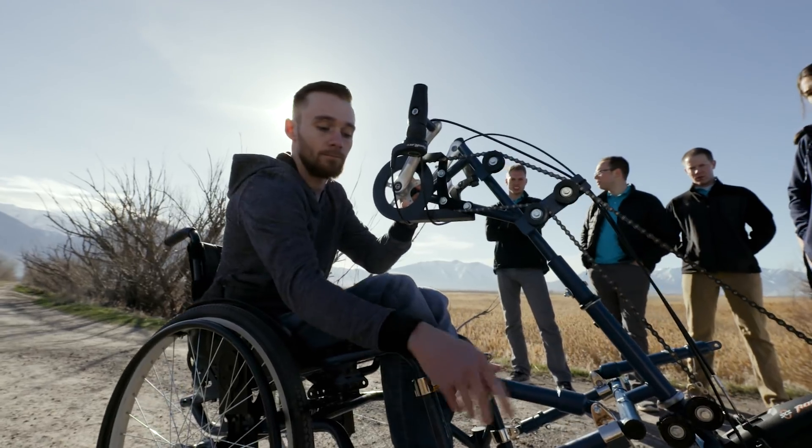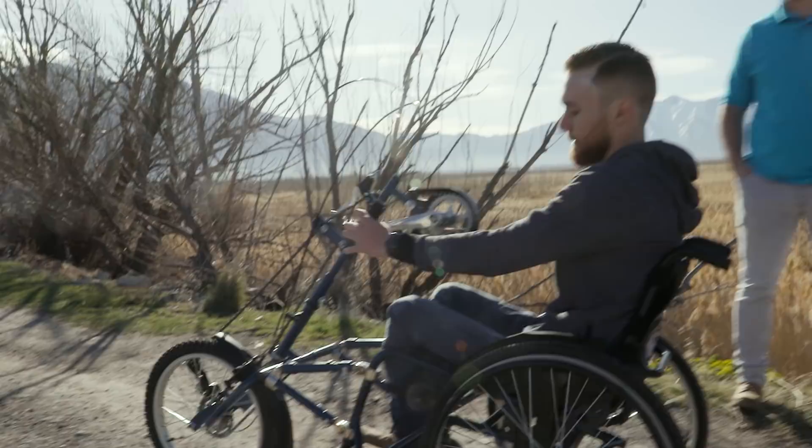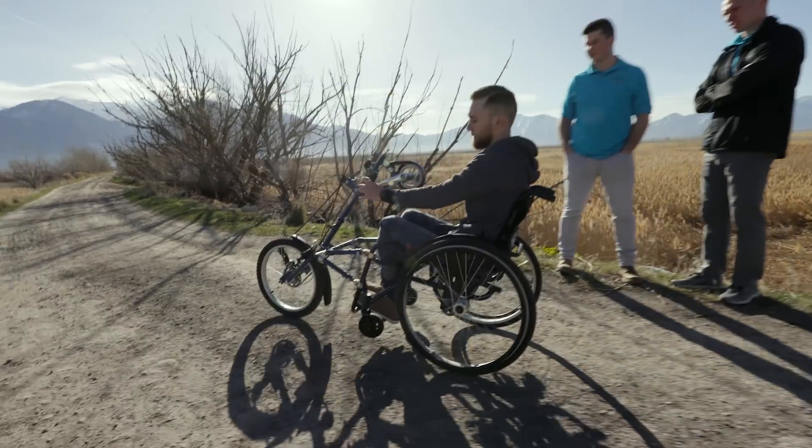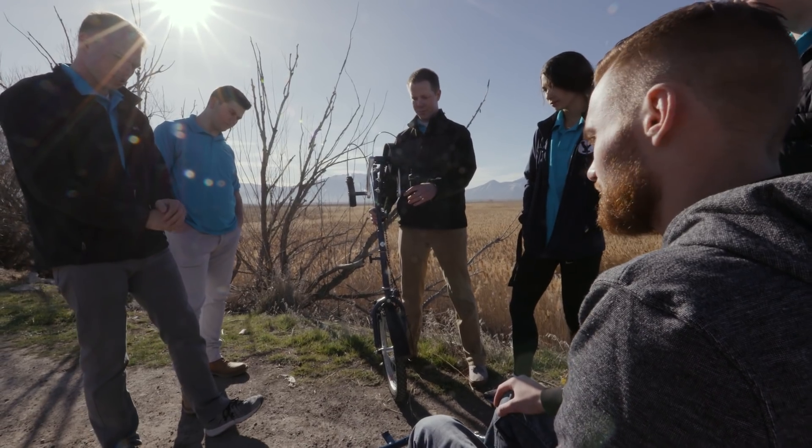There's a lot of benefit to having the trike and getting that movement where you're pushing back and using different muscles. It allows for a more efficient use of your energy. They could go the longer distance to get somewhere, then take the trike attachment off and maneuver and be mobile in their wheelchair in a different environment.